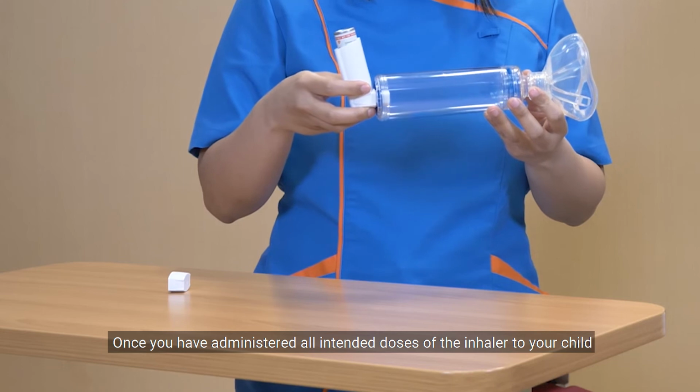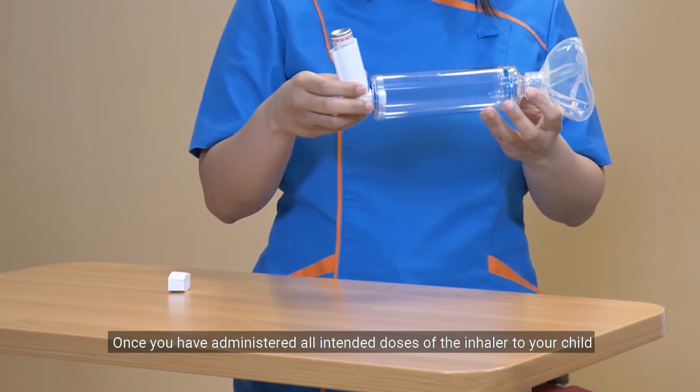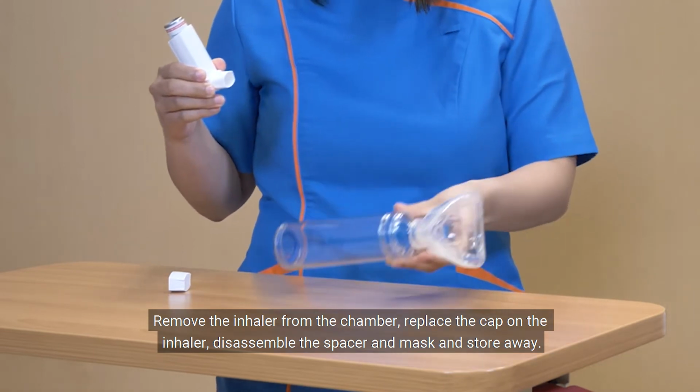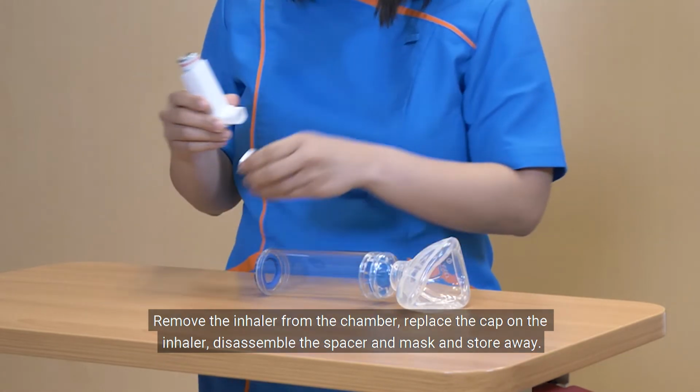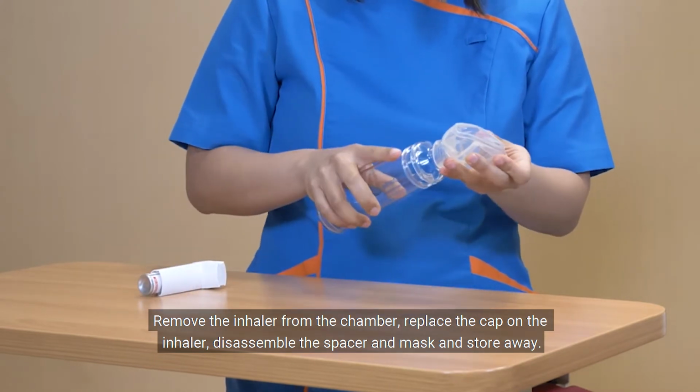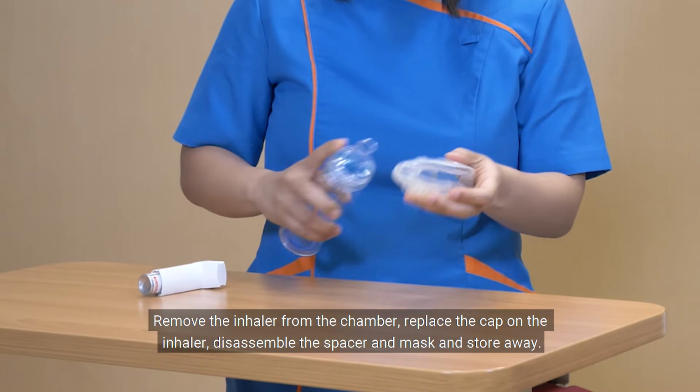Once you have administered all intended doses of the inhaler to your child, you may then remove the inhaler from the chamber, replace the cap on the inhaler, disassemble the spacer and mask, and then store away.